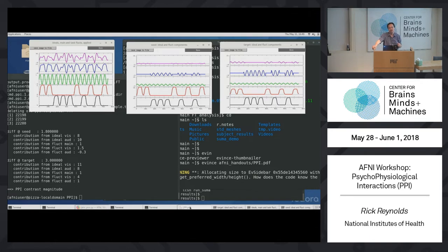You could take the feature, visual minus auditory, and get the highest T, and take that box. You could pick the max seed.